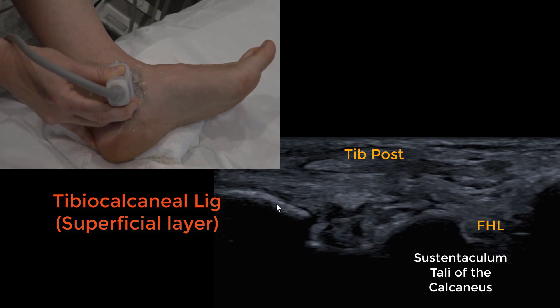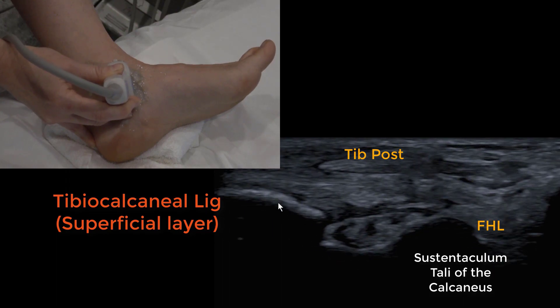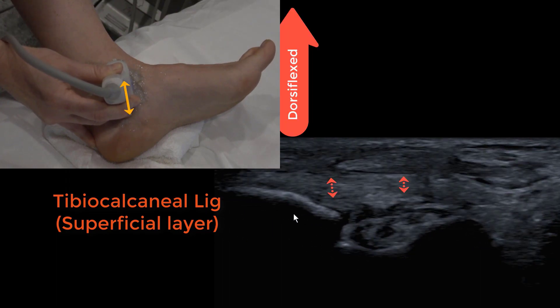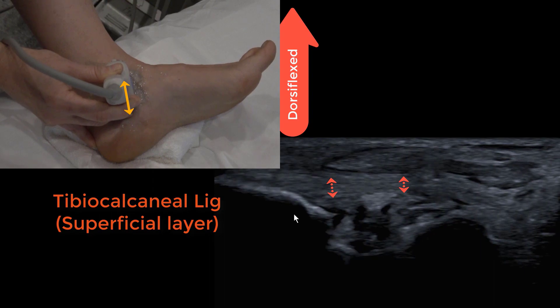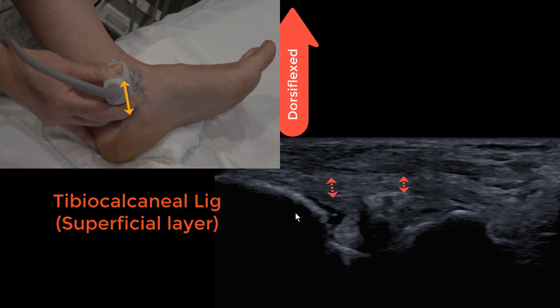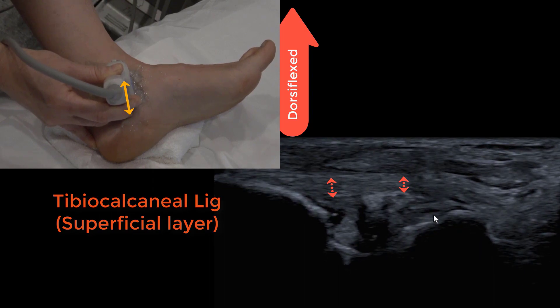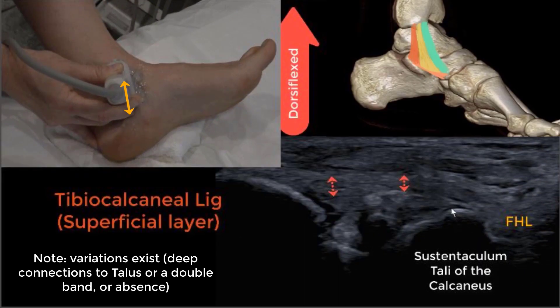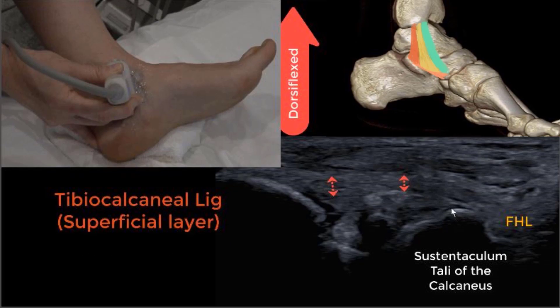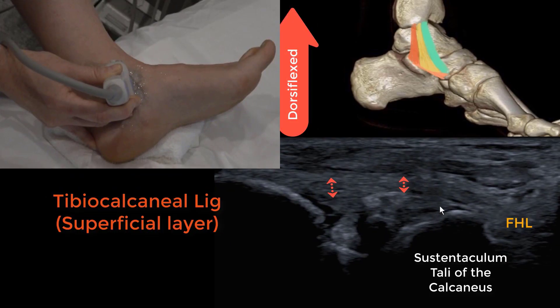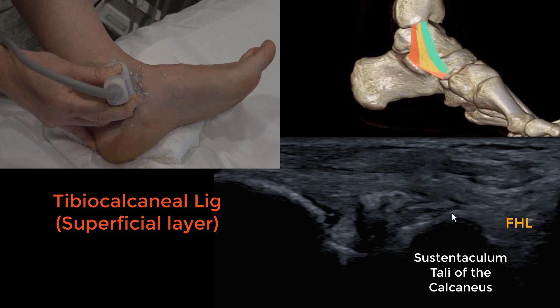If we come a little more forward onto flexor hallucis longus we see sustentaculum tali and we're now towards the anterior colliculus. This is the tibio calcaneal ligament — it's not always going to be present in everyone, but if it is, it's the third superficial band seen in orange in the top right image.